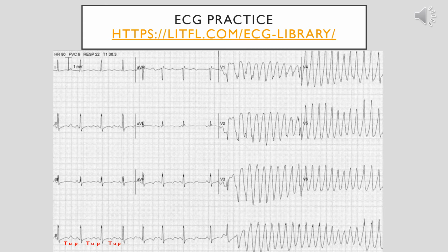scenario data. Looking at P waves and the PR interval, the PR interval is less than one big block between the P and the R. So that's great. We do see a pretty good normal sinus rhythm up until we hit that torsades de pointes. So this EKG has a lot of different findings. Looking at axis deviation, we have positive amplitude on leads 1, 2, and aVF, so all of those look good as far as a normal axis until we get into the VTAC. A lot to read on this EKG. You can see how the T waves are really depressed throughout leads 1, 2, 3, aVR, aVL, and aVF. All of them have really depressed T waves, which is also something that you should see in a patient with hypokalemia.